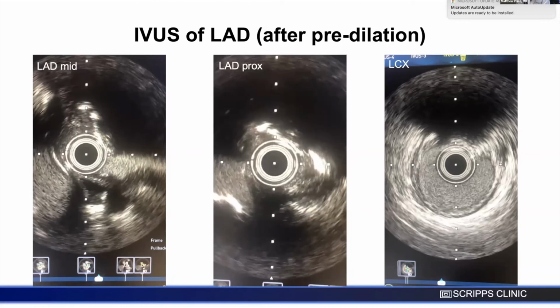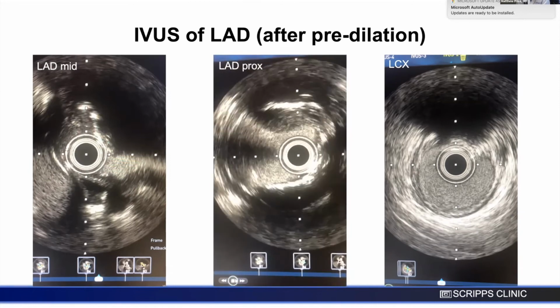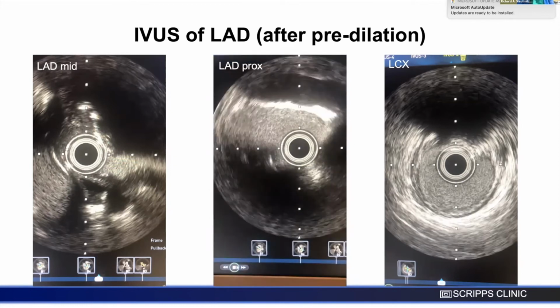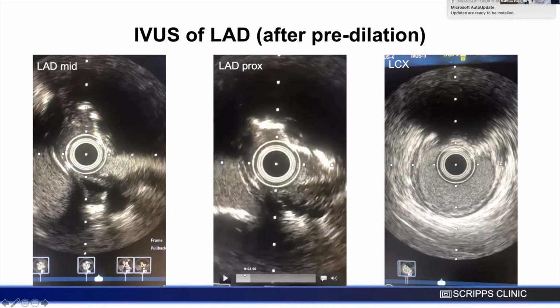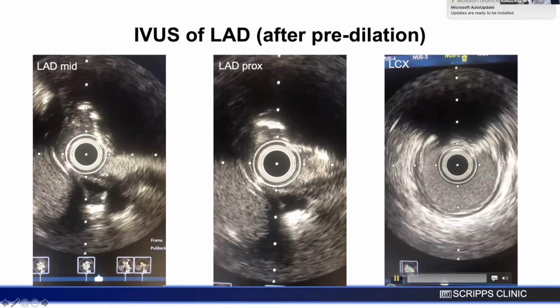Any thoughts on the type of plaque this is? Oh, it looks like you have calcified plaque there, right? Yep. And here's the left main itself. You see the left main, there's calcium here. I'll go back. So again, here is the ostium of the LAD. This is a little nodule there. Yeah, maybe here. Although there's calcium here and here as well, right? So maybe nodular calcification versus the nodule itself, or a heterogeneous calcification. And I don't know why I'm showing the circumflex again?